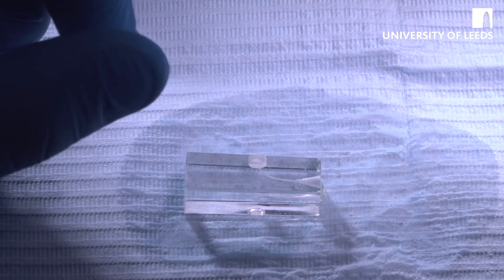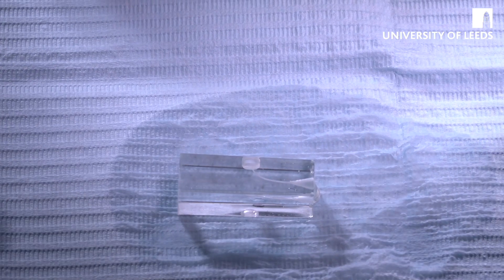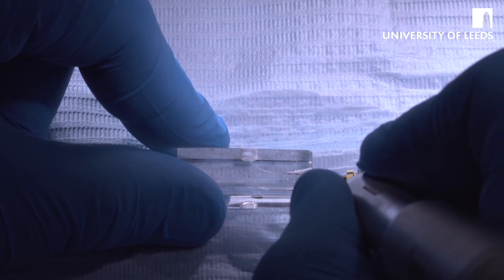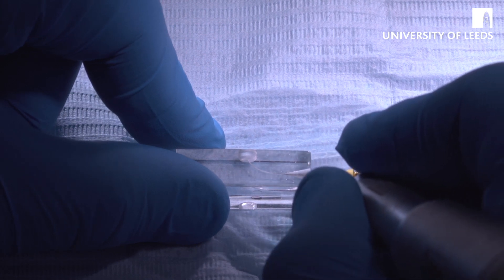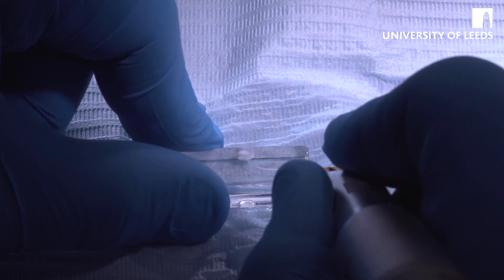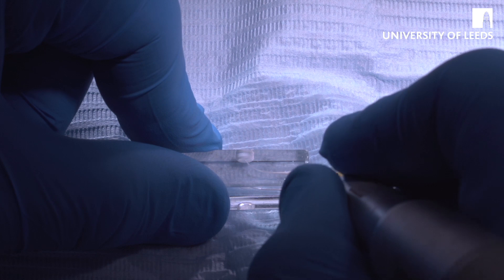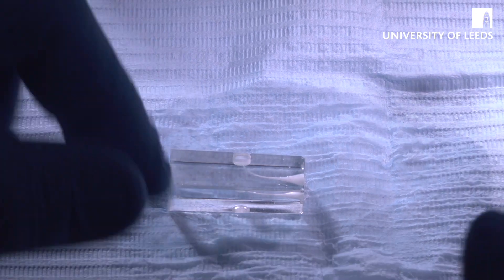Having established our glide path, the next thing is to move on to the Shaper X file, which is what's going to create the coronal flare. Insert it into our motor, set the motor to ProTaper Universal S1 to SX, which is an individual setting on all the motors. Put this file into the canal passively, and then brush it against the far wall — light engagement and brushing against the far wall, predominantly working away from the curve. That reduces the risk of strip perforation, because there's a larger mass of tooth structure away from the curve. You don't need to do a huge amount; you want to retain as much dentine as you can.